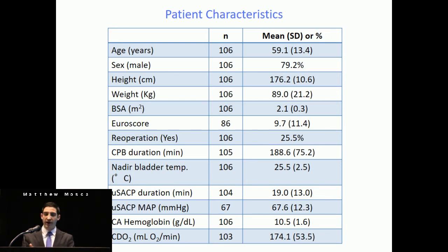Now, I should split this up. For our hemiarches, our fastest hemiarch right now is 5 minutes. We have a pretty quick aortic surgeon. Our hemiarches range between the quickest being 5, so that distal anastomosis being completed and then reperfusing within 5. And we also have to have a good fellow. But most often we are in that single digit right under 10 minutes for our hemiarches, so 7 to 9 minutes.